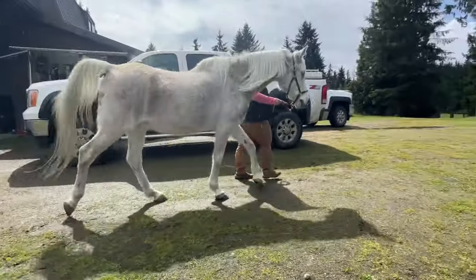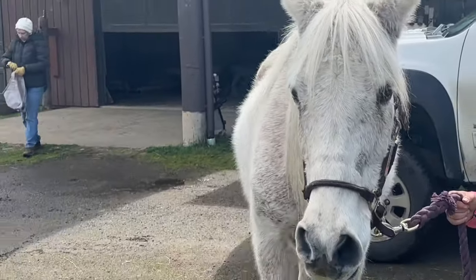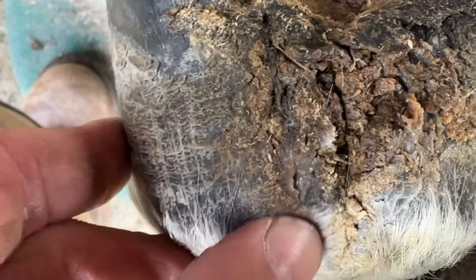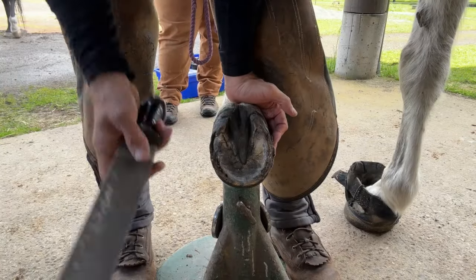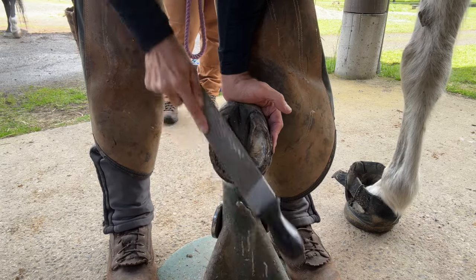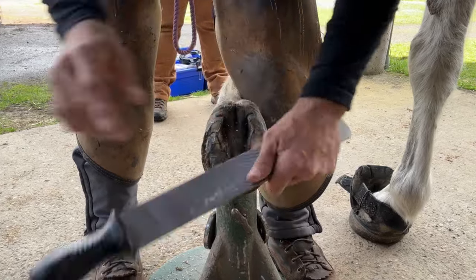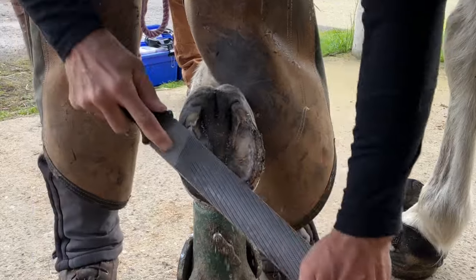Found the Equine Veterinary Hospital asked me to come help with a 29-year-old horse experiencing foot pain. Unfortunately for Mackie, we discovered an abscess in his right front foot heel bulb and decided to wait a week before applying something more permanent than a soft ride boot. This was my first time meeting Mackie and his very caring owners that were concerned for Mackie's health. Besides some arthritis in the lower portion of his feet, Mackie had been suffering from laminitis for the first time.